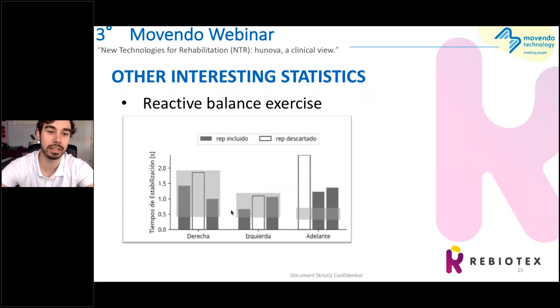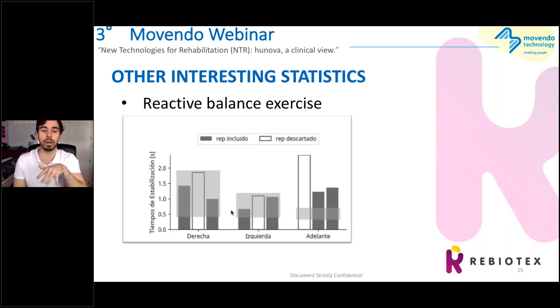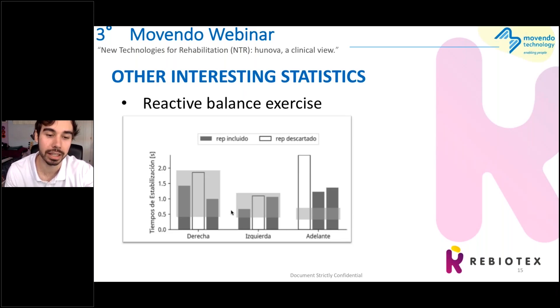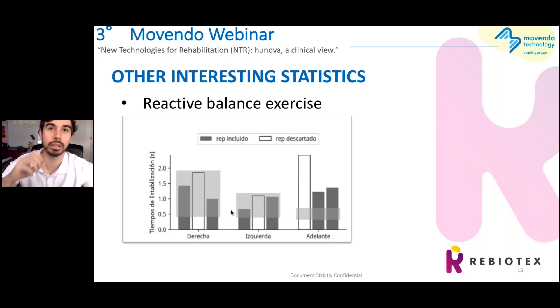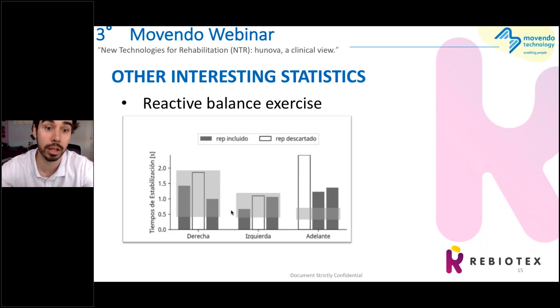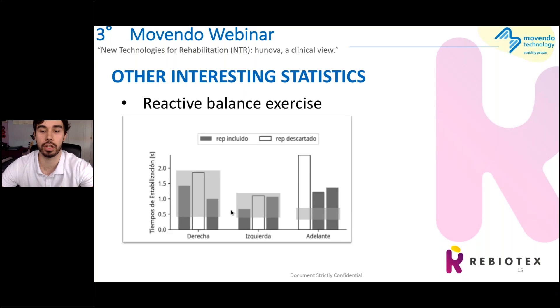This is another interesting exercise — the reactive balance exercise. The patient stands and the platform makes perturbations. The left graphic shows the right perturbations, and we see these are within normality parameters. The measured parameter is the time needed to return to a standing position after a perturbation. We see that for forward perturbation, we are too far from normality. So we have some interesting data to help orientate the treatment.